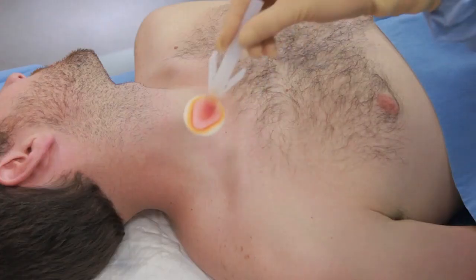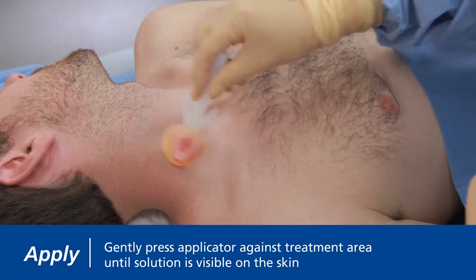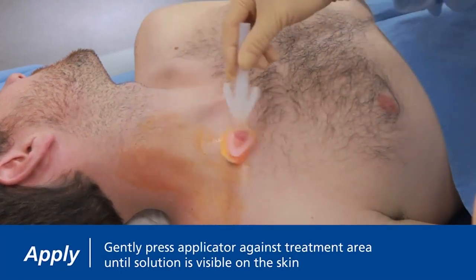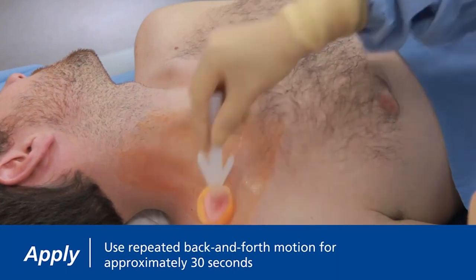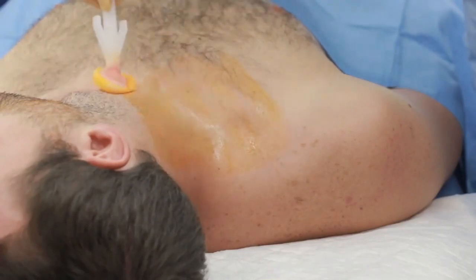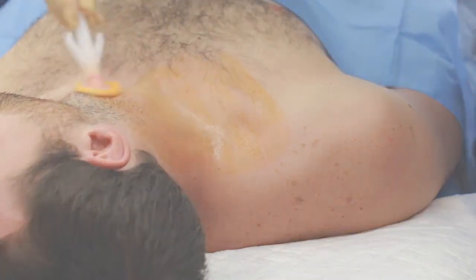With the solution now partially loaded, gently press the applicator against the treatment area to distribute the solution throughout the sponge. Once the solution is visible on the skin, use a gentle back and forth motion for 30 seconds on the incision site. Concentrate at the insertion site for 30 seconds.